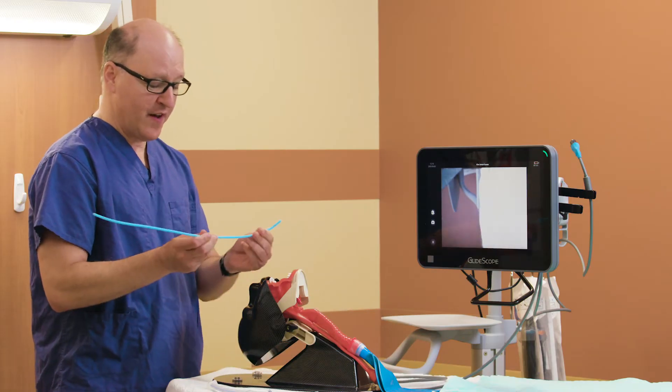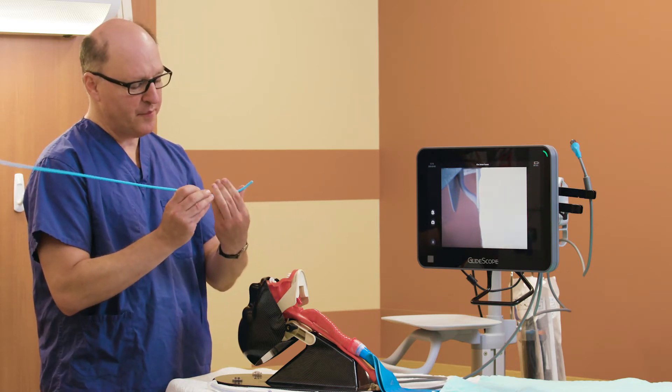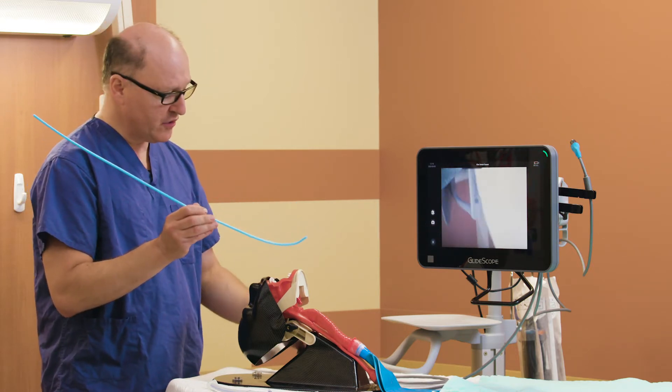A technique that I have found helpful is to take a regular bougie and give it a bit of an upward deflection, just enough so that we can get around the curvature of the tongue.